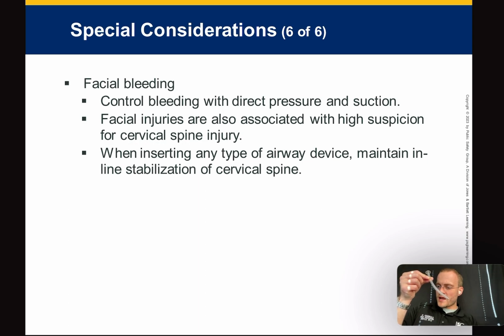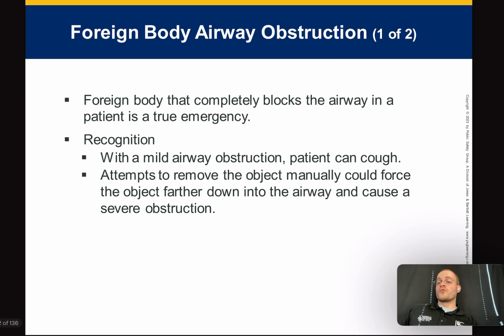NPAs. They can't have them, okay? Why is that? You can push this through the cribriform plate right into the brain. Foreign body airway obstruction, been there, done that.